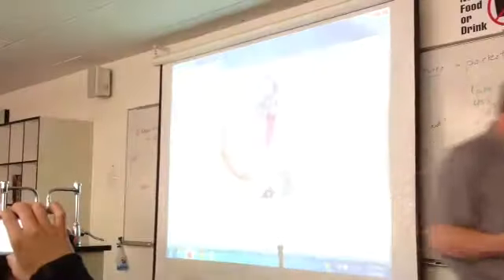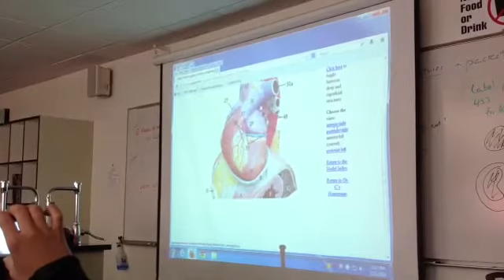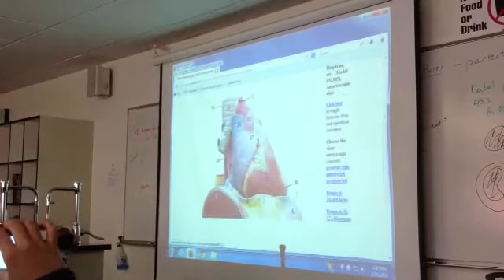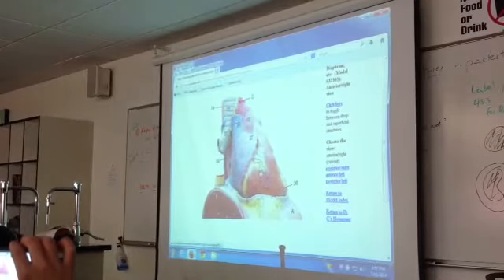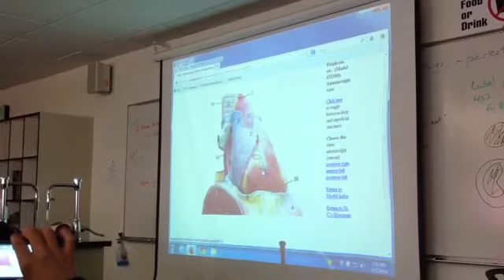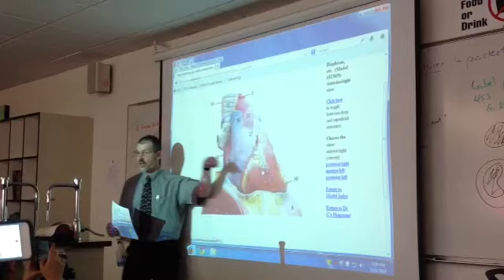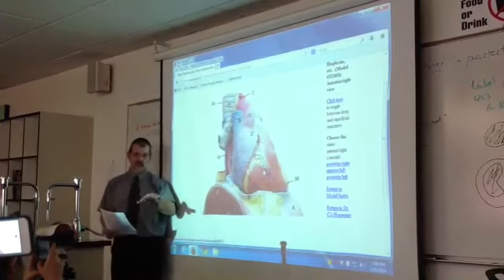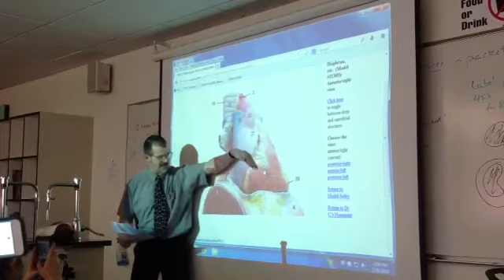Let's go back to this one here. Back to the other side. Okay. Depending on the model you're on, it varies somewhat. On this model, this red one right where my mouse is, I believe is interpreted as being the marginal because it's on the edge. On the other models, it's actually further down. So I'm just going to make a blanket statement. If one of them's over here on the right side, that's going to be the marginal.